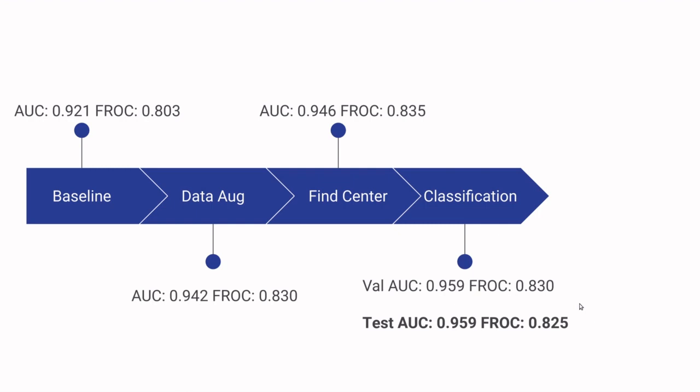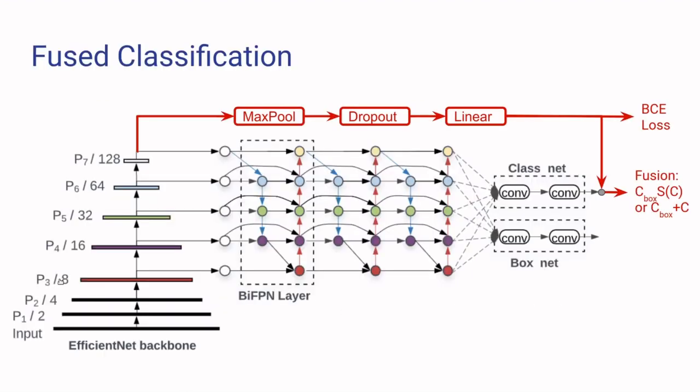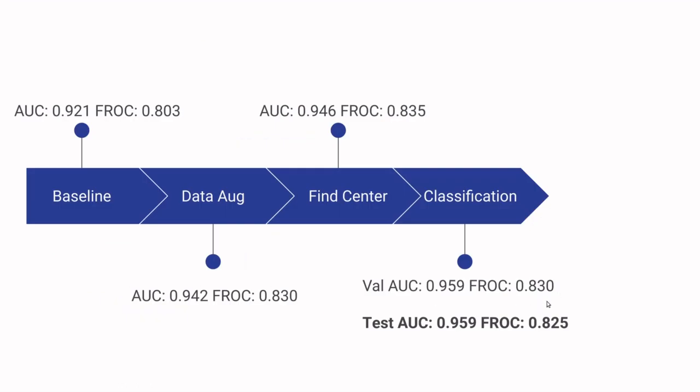That's, I think, due to the fact that I just added the classification loss directly to the overall loss, which means the classification takes more weight in the overall loss, which also results in the localization or bounding box loss having less weight, as reflected in the final localization score decreasing a little.